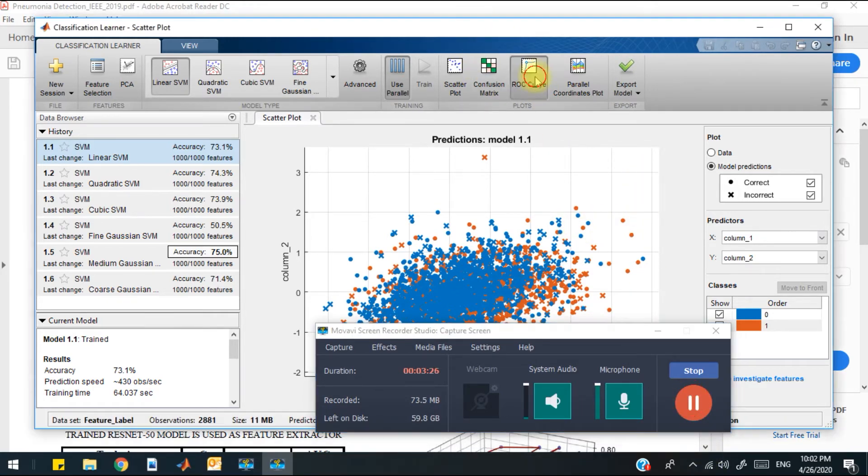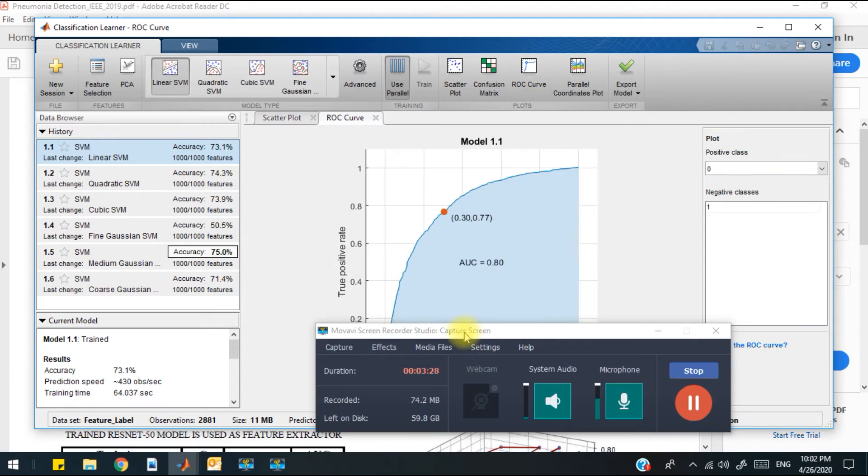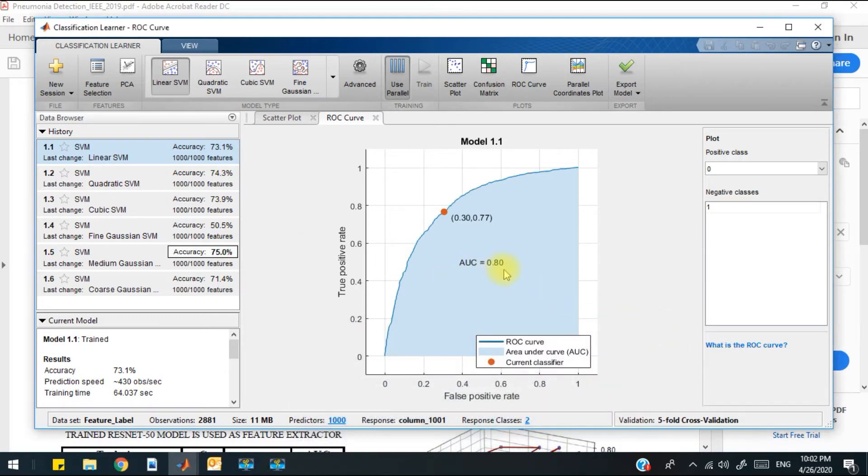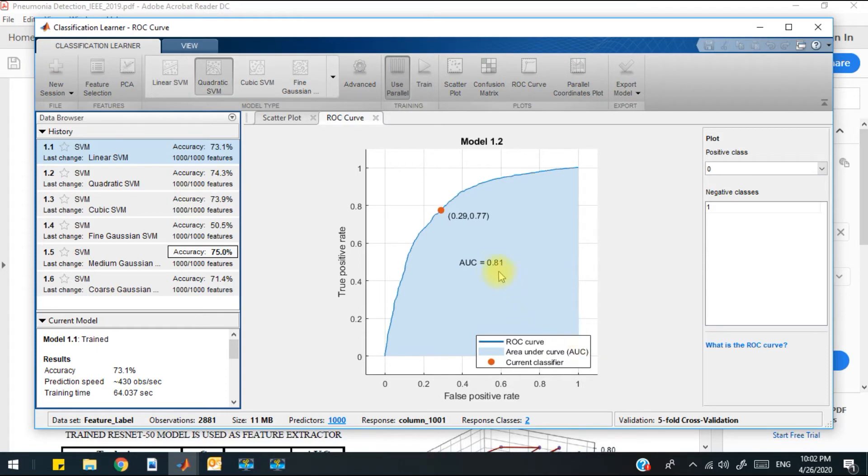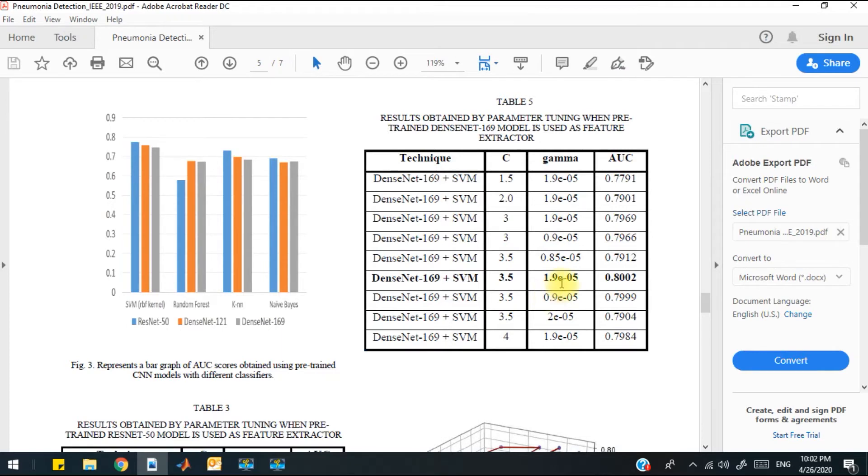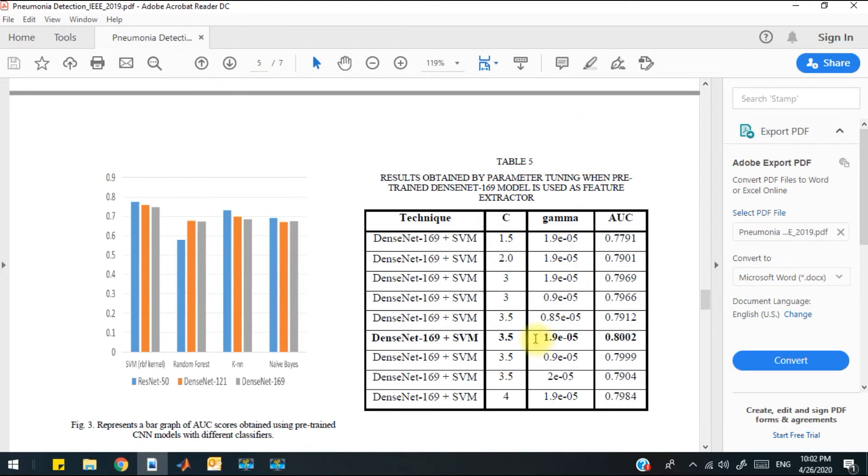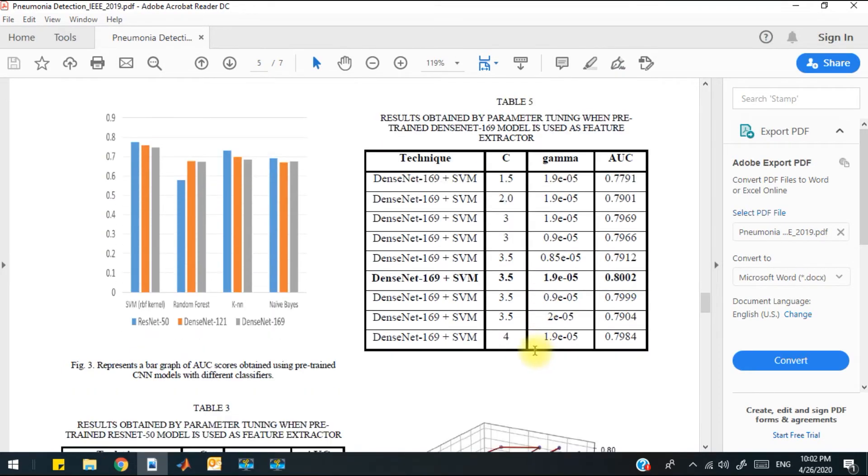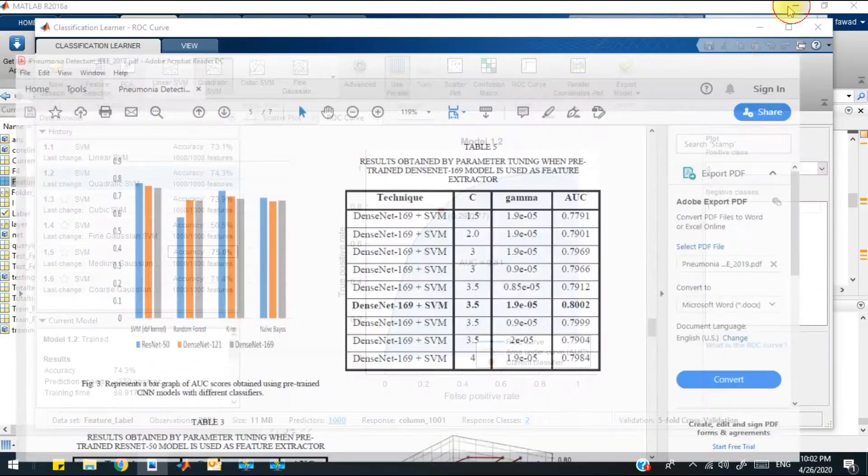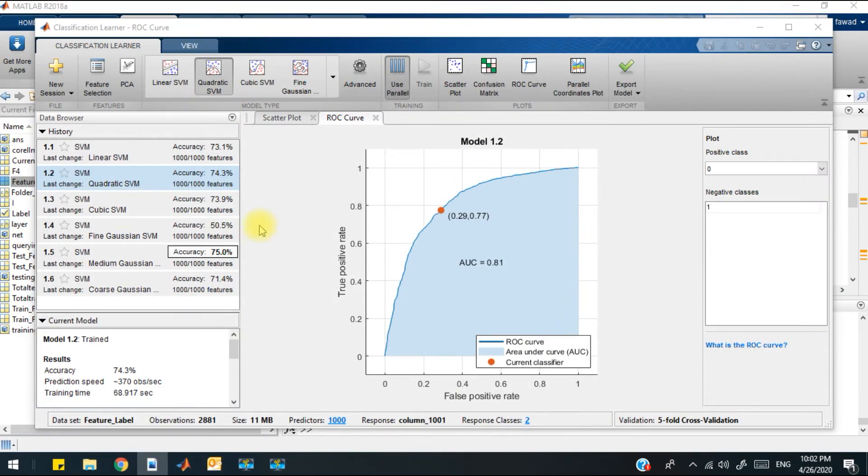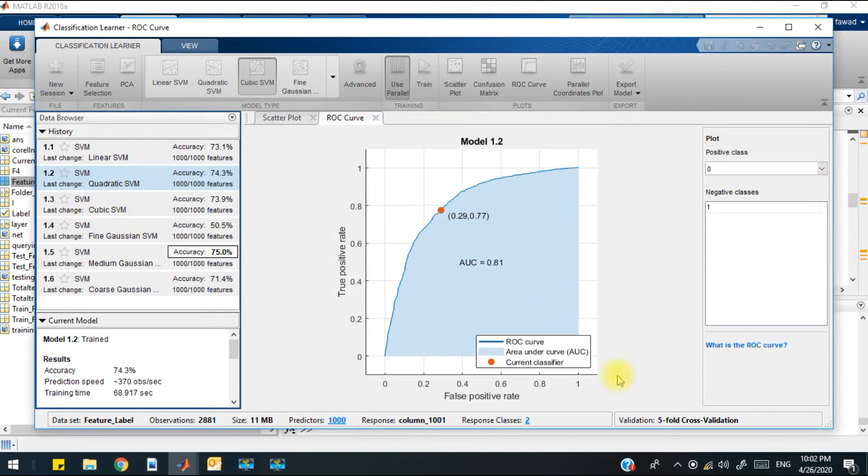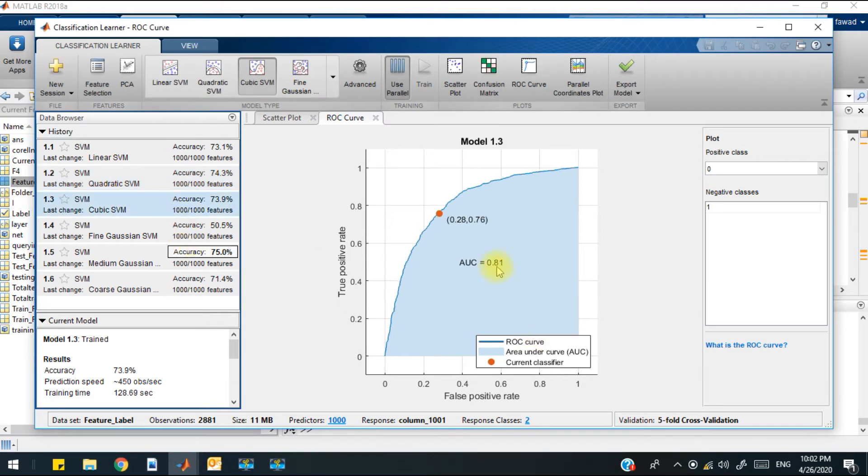The AUC value that we have achieved over here with linear SVM is 0.8002. The AUC value is 0.80. With quadratic, we have achieved 0.81, which is better than the research paper's highest accuracy. Through cubic SVM, the AUC value is also 0.81.